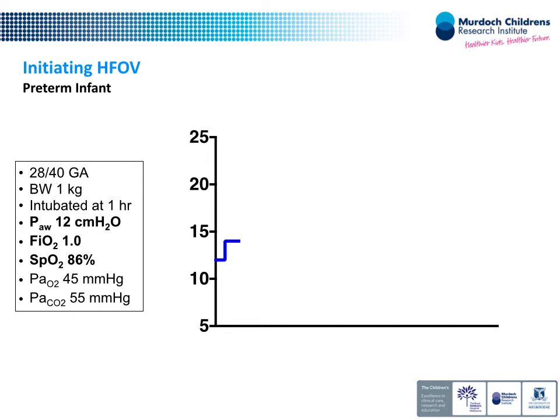But the take-home message, from me anyway, is that chest X-ray is very good at telling you you've got a really, really low lung volume, profound atelectasis. It's very good at telling you you're about right. It's very good at telling you you're grossly overdistended, you know, the flat ribs, the bulging stuff. It's not very good at telling you that you should use 12 instead of 14.